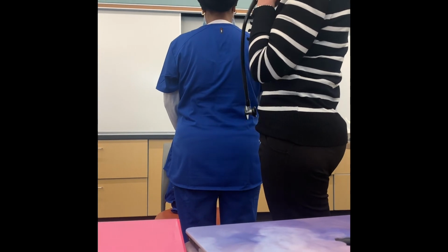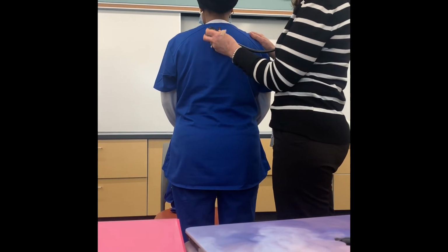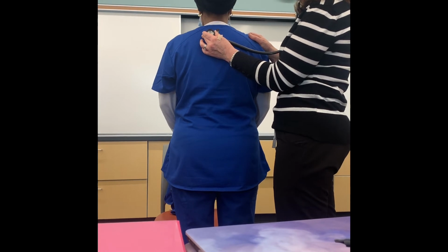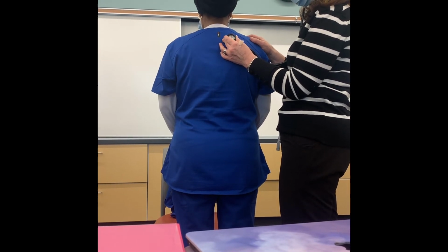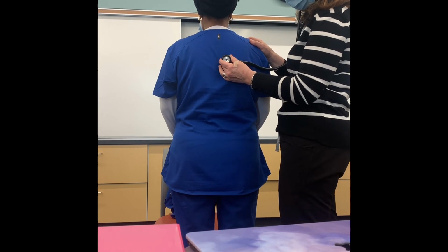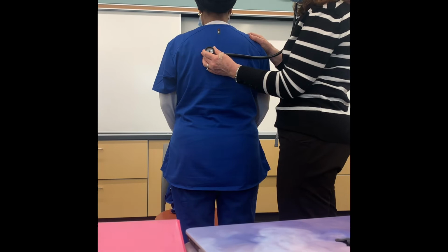I'll ask my patient to take a breath every time I move my stethoscope. And then I'm going to go from here to here, and down here, and one more time.